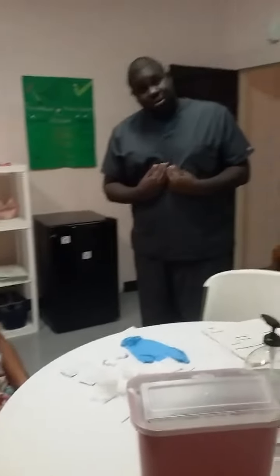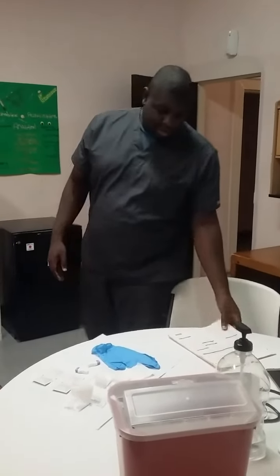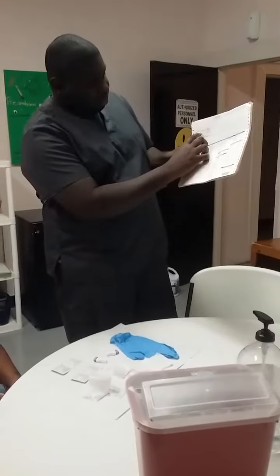The next step is to greet the patient. You want to identify yourself, and also identify the patient to make sure that this is the correct person you're doing the procedure on. So I'm going to say, hello, my name is Ricky. I'm from the lab. Would you please give me your first and last name? I'm Mrs. Simmons. Okay, I've identified myself to the patient, and now she's identified. Normally the requisition form will have the patient's name, the date and time, and so on. So it would probably say Amisha Simmons on there. So now I know it's the correct person, and we can begin.